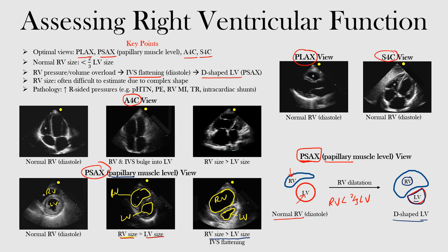Notice the intraventricular septum flattening here. In the earlier image it was still a little round, but in the third image on the right, the right ventricle is much larger and flattening the septum. Notice that the intraventricular septum — the division between the right and left ventricle — that line is now flat. That's what we call the IVS, the intraventricular septum, and this is now flattened. You get that D-shape of the left ventricle, what we call the D-shaped left ventricle.